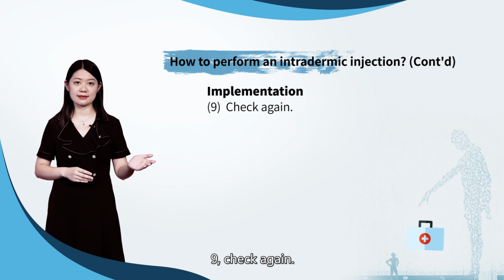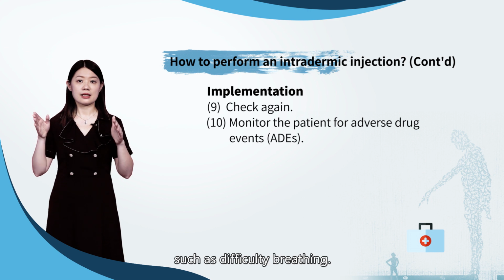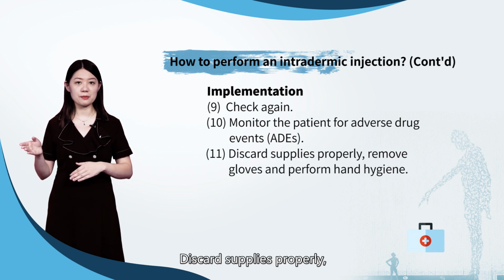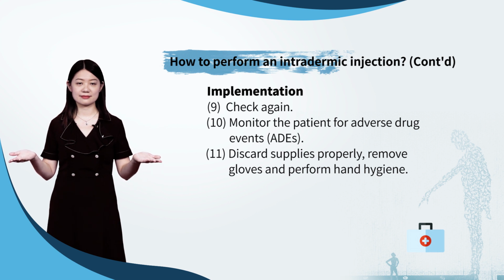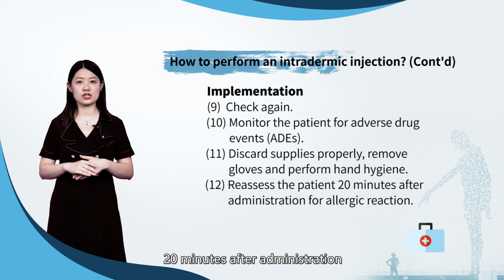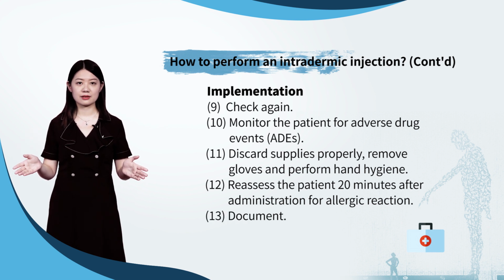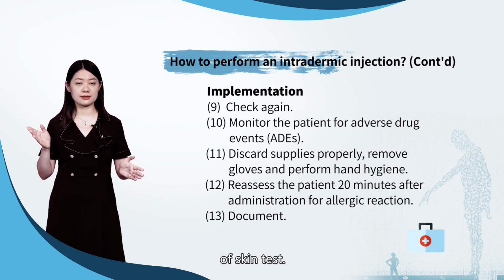Nine, check again. Monitor the patient for adverse drug events such as difficulty breathing. Then discard the supplies properly, remove the gloves and perform hand hygiene. Reassess the patient 20 minutes after administration for allergic reaction. And the last step is documentation. Document the procedure and findings and note the result of the skin test.